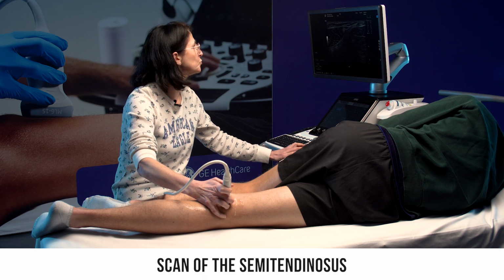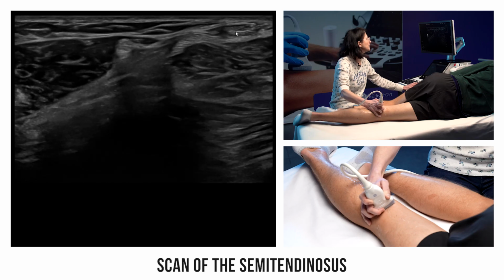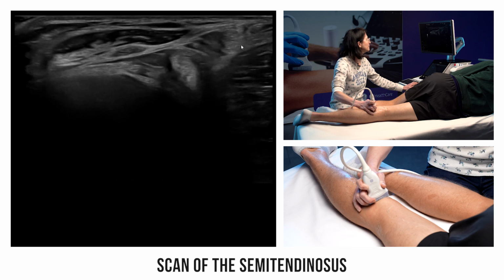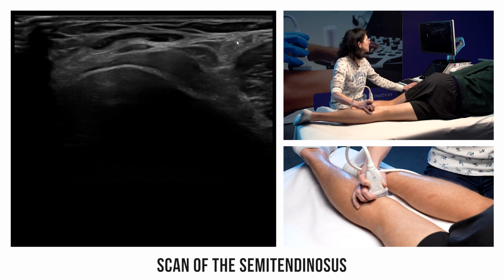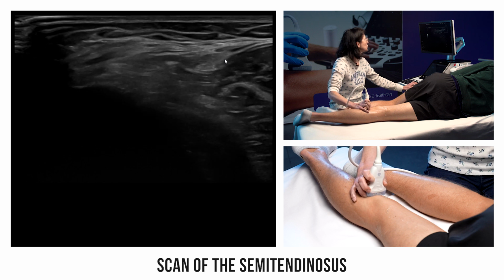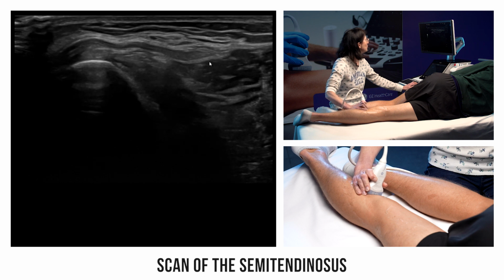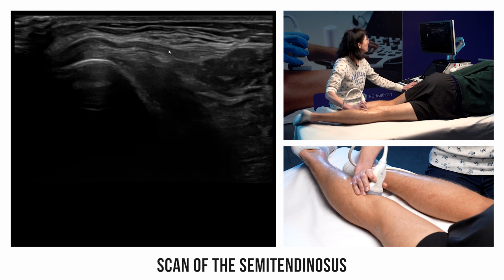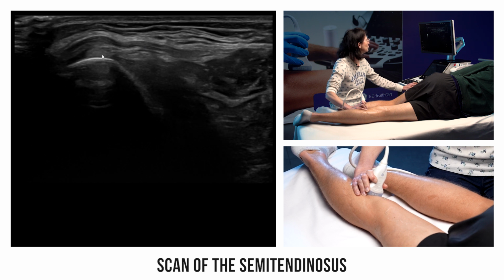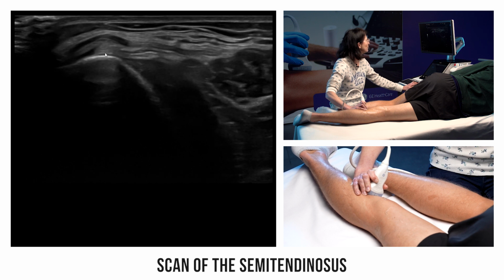Starting at this probe position, let's follow the pes anserinus tendons one by one, starting with the semitendinosus. We go down and forward while staying perpendicular to the axis of our tendon. You can see that it is still in the short axis. I go down without changing the angle of my probe. You can see that the fibers are now practically horizontal towards the front here and cover the medial collateral ligament, which is practically at its insertion.